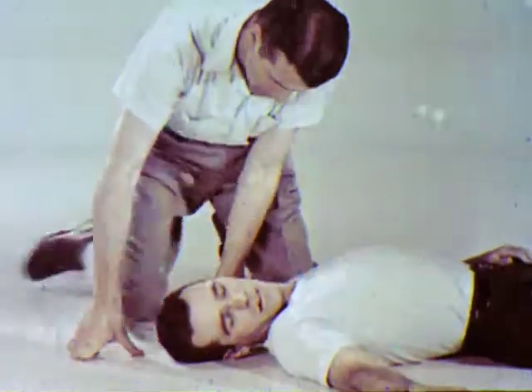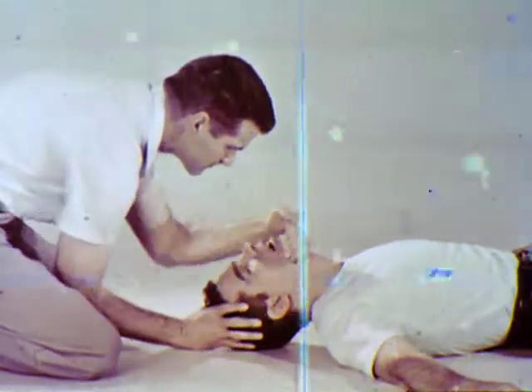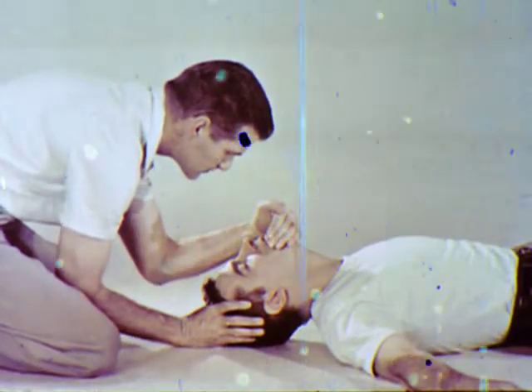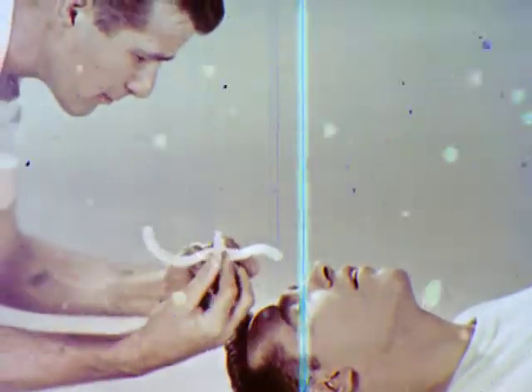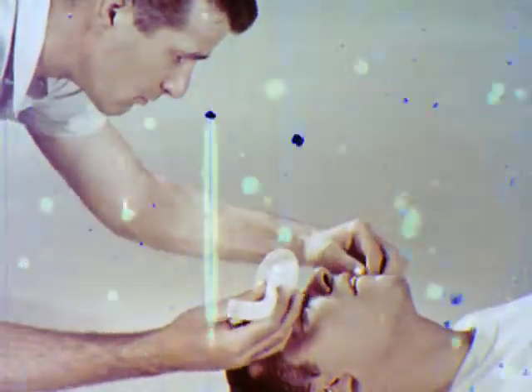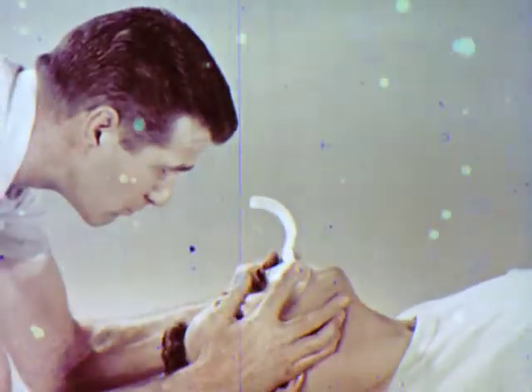There are many cases where an unconscious person may still be breathing. Unconsciousness alone may kill by air passageway obstruction. Very frequently, this type of asphyxia can be prevented just by tilting the head backward. You must maintain the victim's head and jaw in this position until he regains consciousness. If this is not effective, insert the short end of the resuscit tube. Use the short end of the tube to prevent gagging when the jaw is tight or the victim is partially conscious.